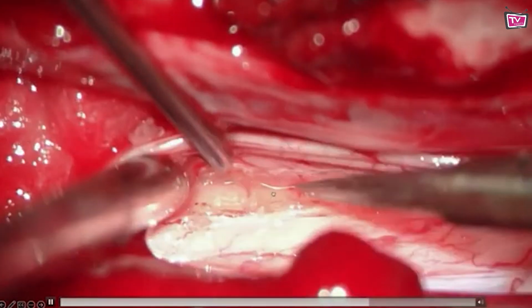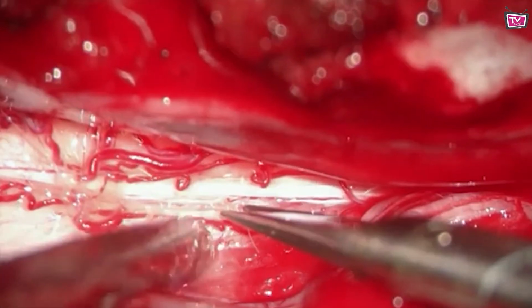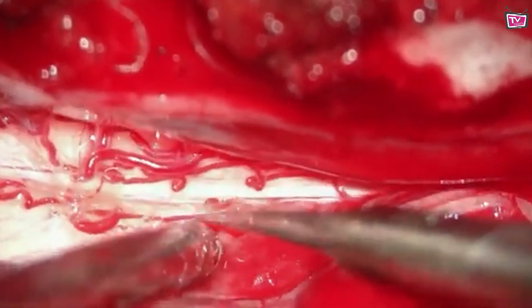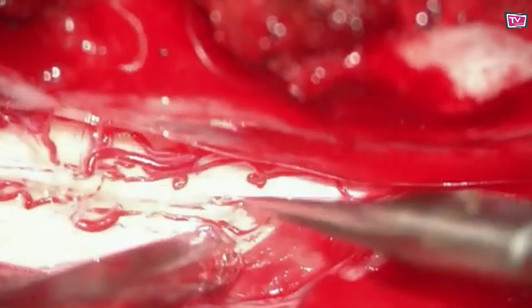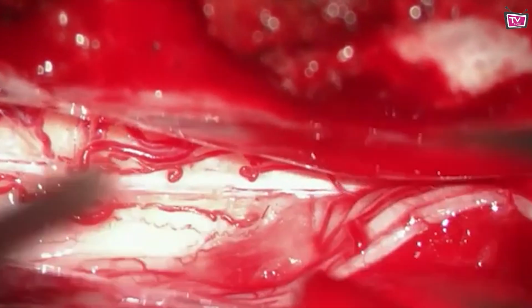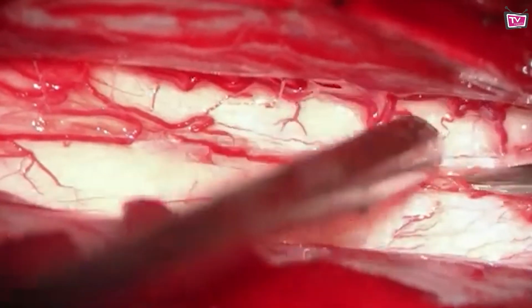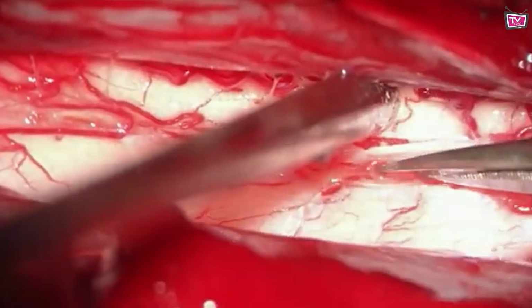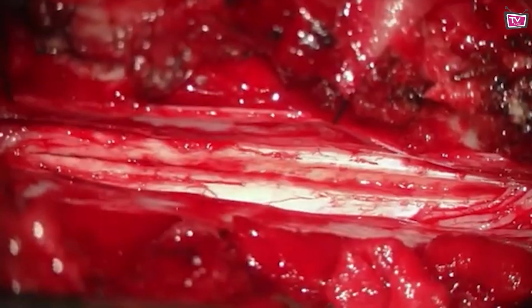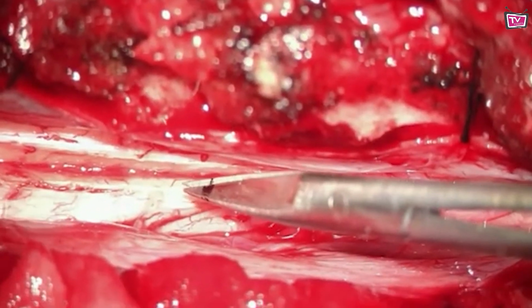Here, these are the microvasculature which are dipping inside the sulcus, and this sulcus is between 2 fascicles. It is easy and then it opens up. In this case, because it is a post-traumatic avulsion, there was gliosis to be seen. You can see we have marked the tip of the scissors with a marker so that we don't lose our depth of lesioning. Then we go up to 2 to 3 millimeters depth. This is how it opens up, and that is the end of the procedure. So you can see the marking there.